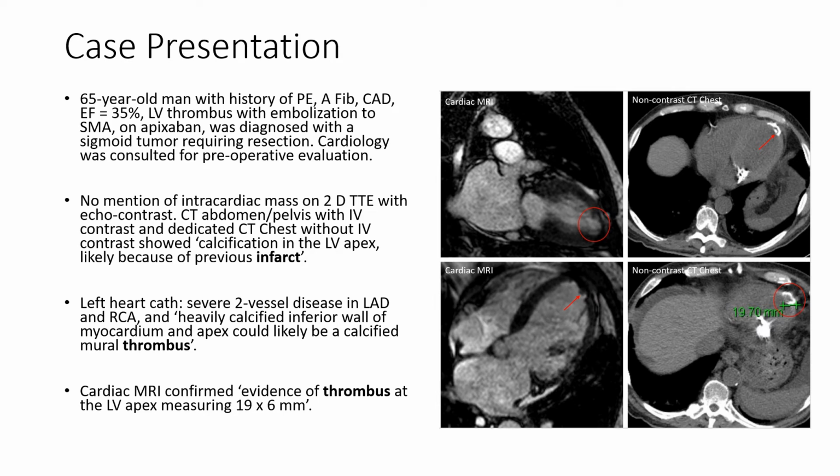A CT abdomen pelvis with intravenous contrast that had diagnosed this tumor had also noted myocardial calcification in the left ventricular apex compatible with prior myocardial infarction. A 2D transthoracic echocardiogram with echo contrast the next day did not mention an intracardiac mass.